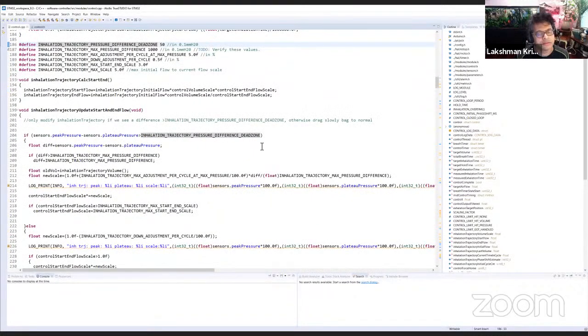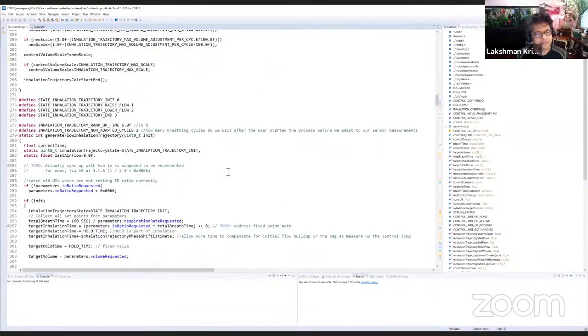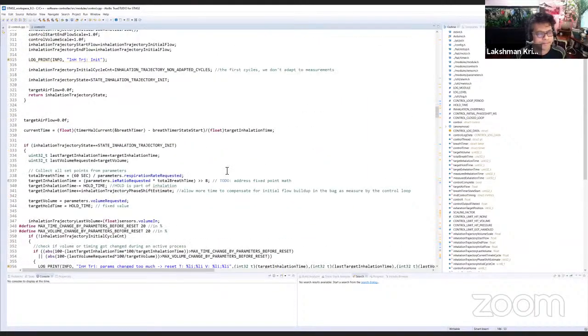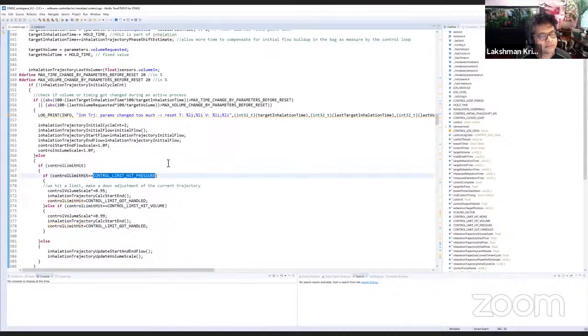There are a couple of safety measures in place here. So let me find, where was it again? We have, for example, pressure limits and flow limits. If you set a certain flow and we go above it by 20%, we stop it right away. If you set a certain maximum pressure, I think it's even a parameter in the UI which you can set, it only uses a certain maximum amount of pressure, and if this is hit, it will first back up and at some point even stop.